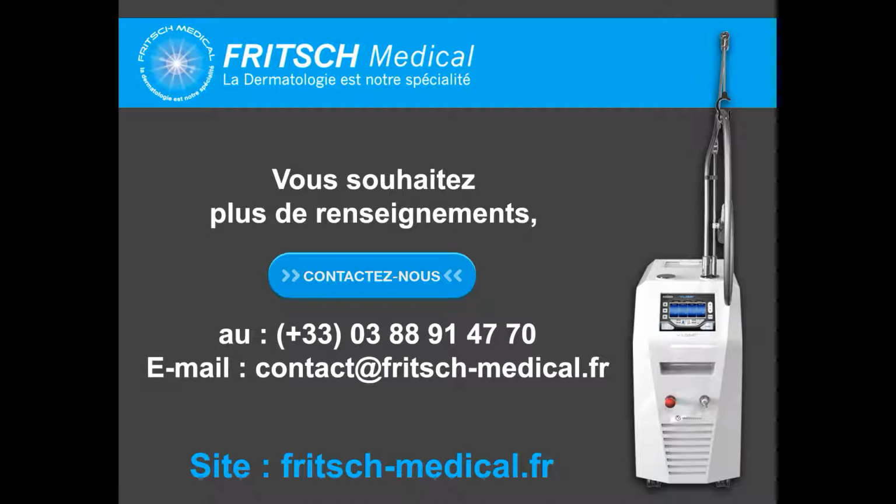You know, sometimes I put my gel from the freezer and I accumulate with a cooling handpiece also. So normally for skin pigmentation, 10 degrees is enough. For redness with KTP, 5 degrees is enough. For Nd:YAG, 5 degrees always.